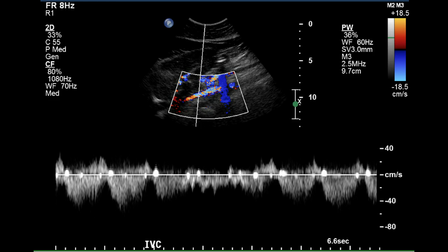This exam indicates normal blood flow in both renal arteries. The renal artery to aorta ratio is clearly under 2.5 in all segments of both renal arteries. There appears to be low resistance flow and sharp upstroke — lack of parvus tardus in the waveforms of the larger vessels. This is a normal exam.